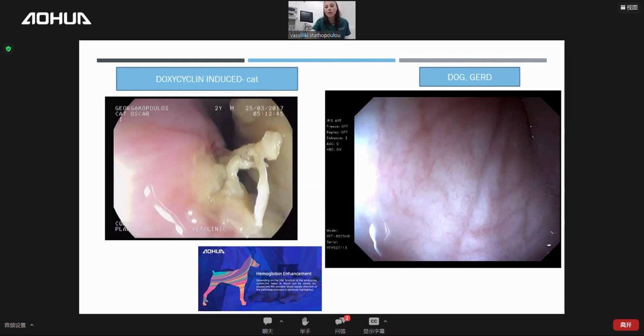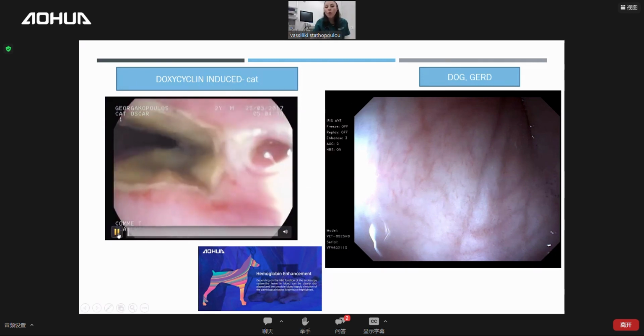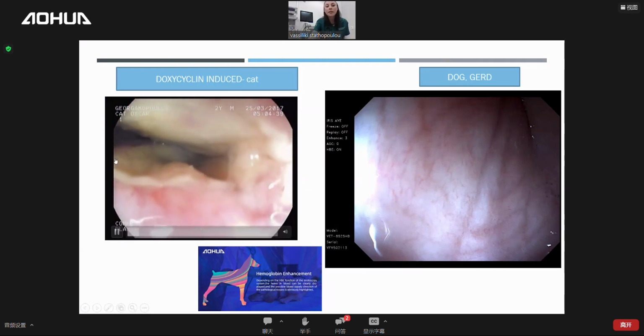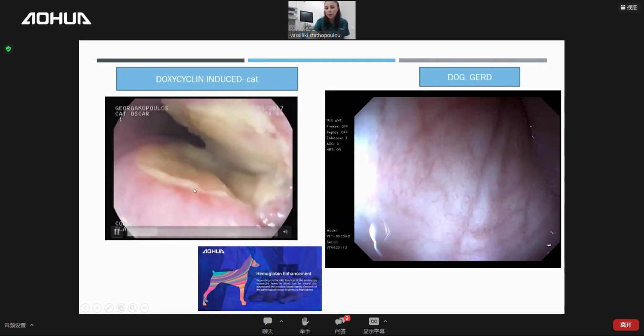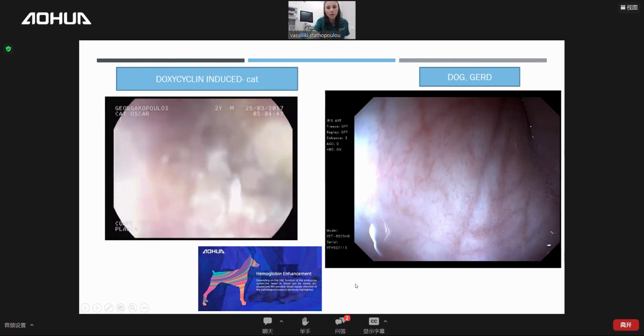It's very, very essential. And here we caught the ulcer because this cat was inappetent, very vocalizing. Great appetite at first, but when apprehending the food, the cat was vocalizing and doing this thing that was suggestive of a problem in the upper esophageal area. And a stricture was beginning to form. This is pseudomembranes. This is necrotic tissue because we took a biopsy from that. Okay. So please be cautious with cats.